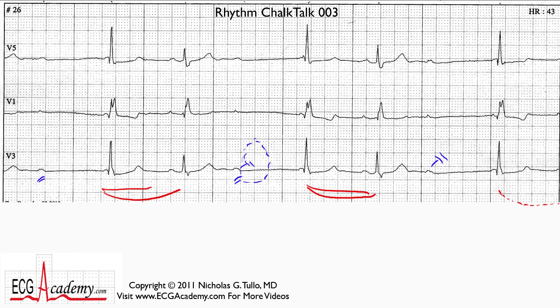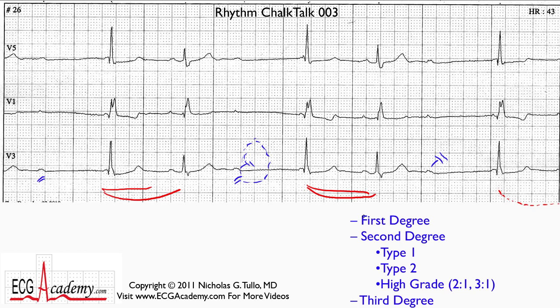Let's review our classification of AV block. A lot of people would look at this and say there are P's and QRSs all over the place — could this be third-degree complete heart block? The answer is no. In order to have third-degree AV block, none of the P waves should be getting through. If none get through, the ventricular rhythm has to be some kind of escape rhythm, and the QRS complexes will be regular. These are not regular, so third-degree AV block is not present.